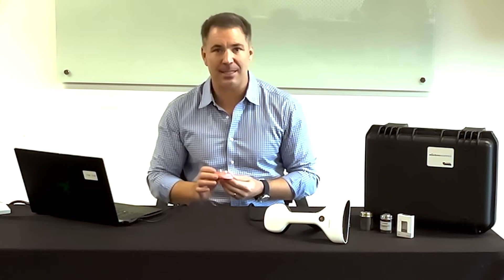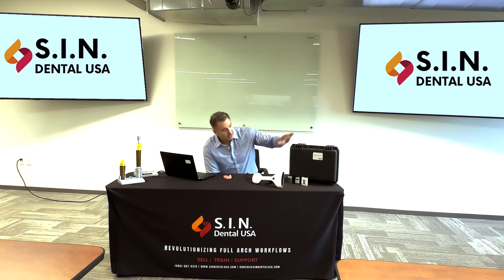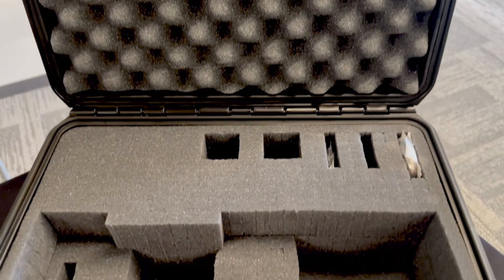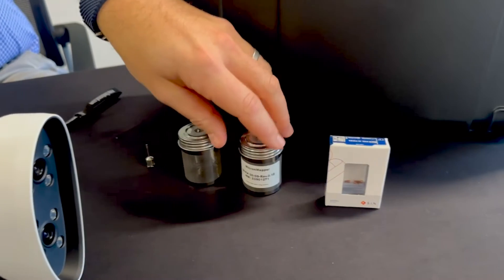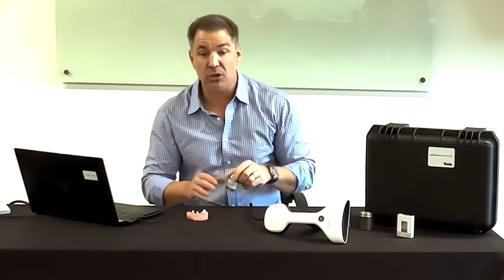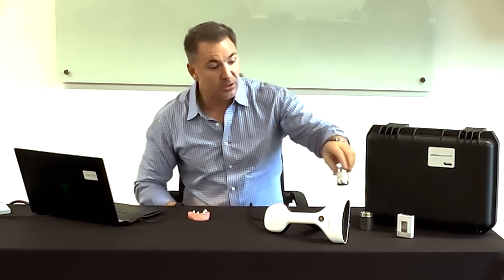What else comes in the Micron Mapper box? You get a hard case, which is great for a traveling surgeon, prosthodontist, or doctor who goes from office to office across multiple locations. It's a very durable container with styrofoam inside so you can travel without worrying about damage. You'll also find two tin canisters, which are meant to be sterilized with the scan bodies and drivers — though you don't have to use them.